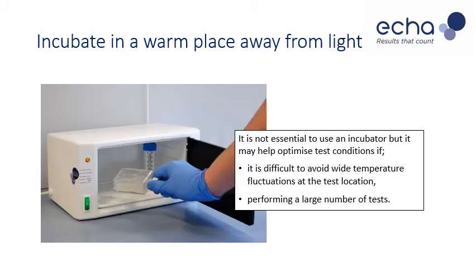If it is not possible to find a suitable incubation location with a reasonably consistent temperature, then we can supply small incubators which help optimize the test performance. A larger incubator may be appropriate where a user is performing a large number of tests.